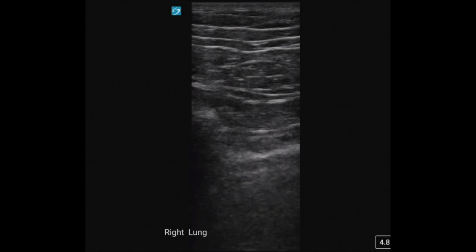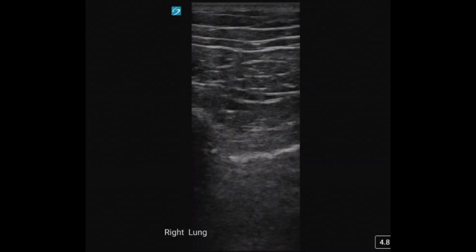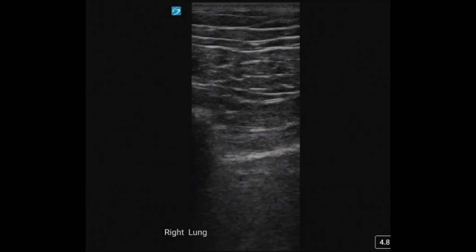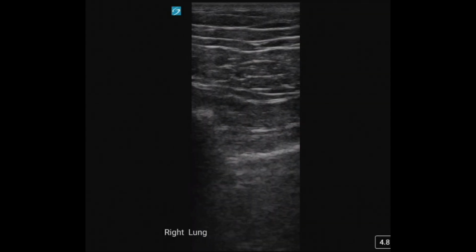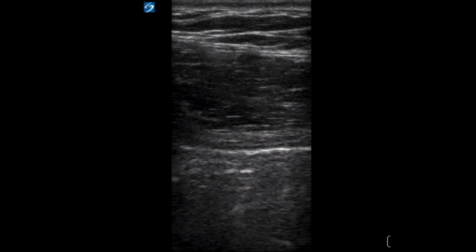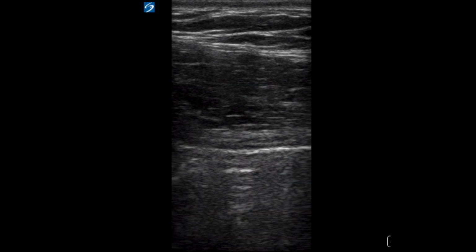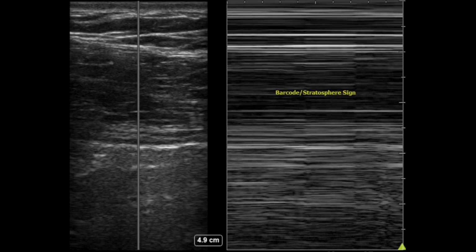Can you elaborate on that? Yeah, so the EFAST essentially just adds the lungs to the FAST exam. If you are scanning the front of the chest, you want to go to the anterior chest and the midclavicular line. Absence of lung sliding, which you can quantify using M mode, you would see a barcode sign, and that could indicate pneumothorax. And if you see free fluid in the thorax, that could potentially indicate hemothorax.